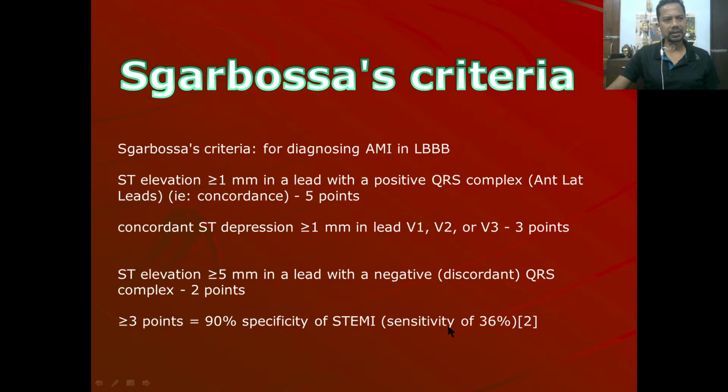So these criteria will help us to be slightly more accurate, but in the end it is your individual diagnosis, and the patient's life lies in your hands, and you have to know your stuff, diagnose, and do the best you can for your patient.